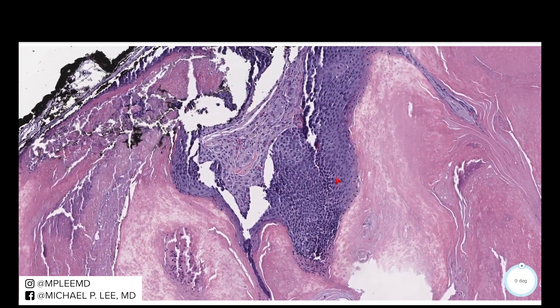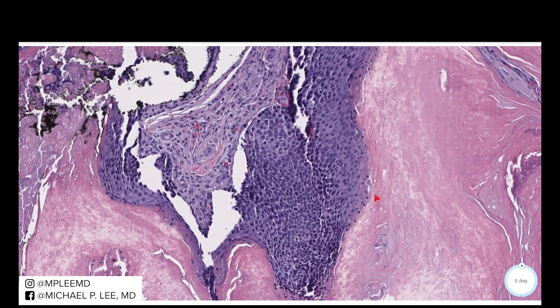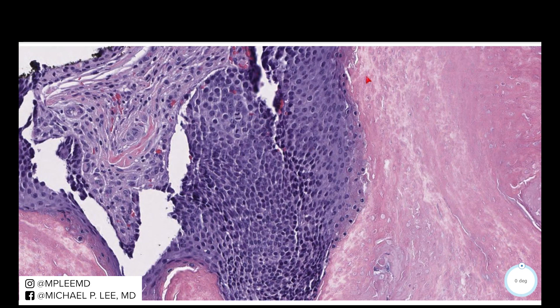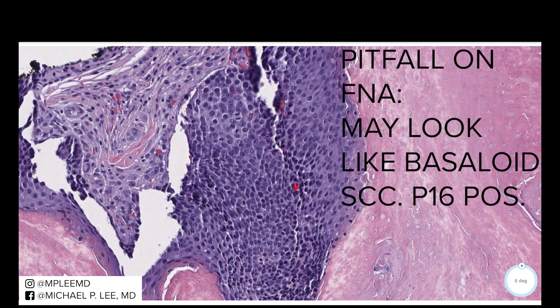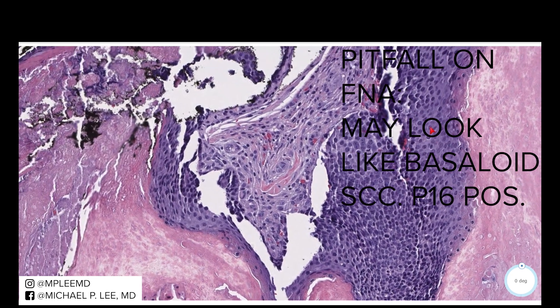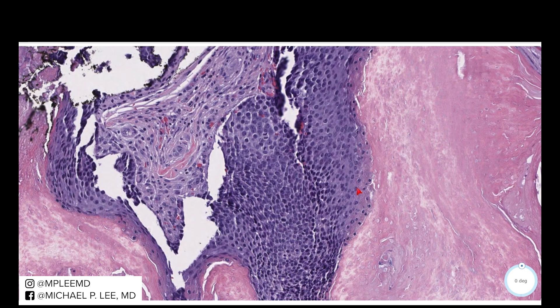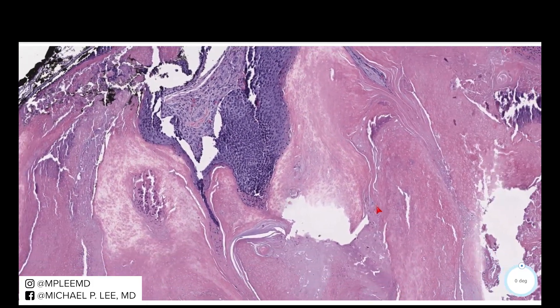A diagnostic pitfall I'd like to share: this basaloid rim can be extremely primitive, with crowding of cells and some mitotic figures. This is a diagnostic pitfall on fine needle aspirate of neck lesions. When you aspirate a lesion in the neck, these basaloid cells along the rim are frequently P16 positive. Since we use P16 as a surrogate marker for high-risk HPV, the pitfall is aspirating these basaloid cells, finding them very atypical, throwing P16 on it, and getting a positive result. Recognizing this possibility makes us less likely to make that error.